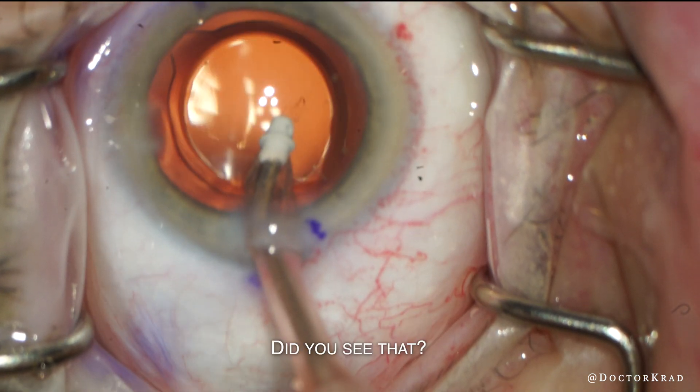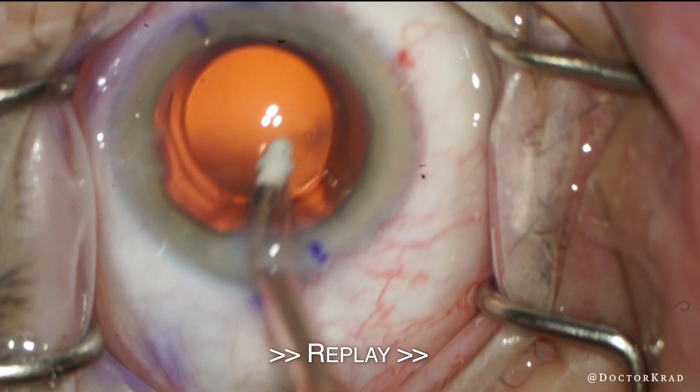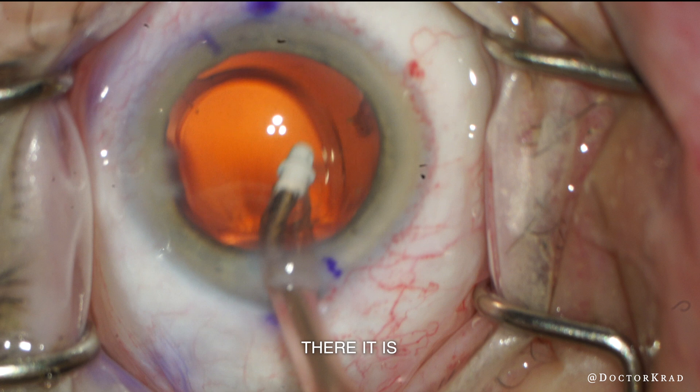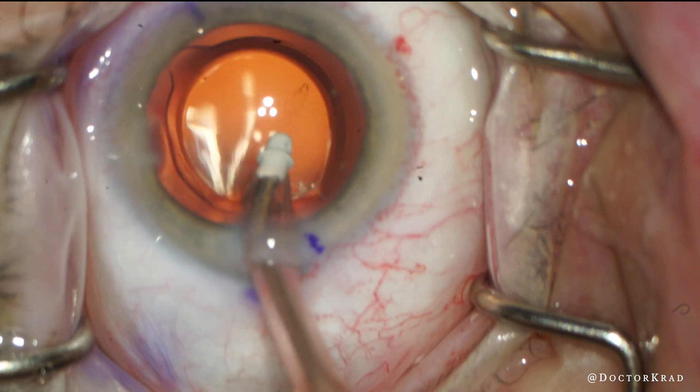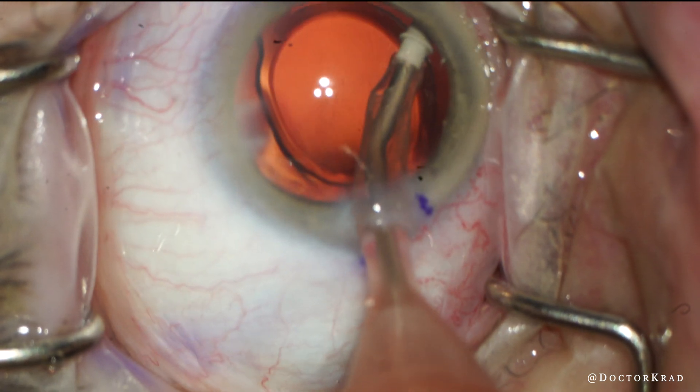Wait, did you see that? Let's pause and then rewind. There it is. When this was happening so quickly, I thought maybe either it was a piece of cortex or there was a tiny lens fragment way in the periphery.